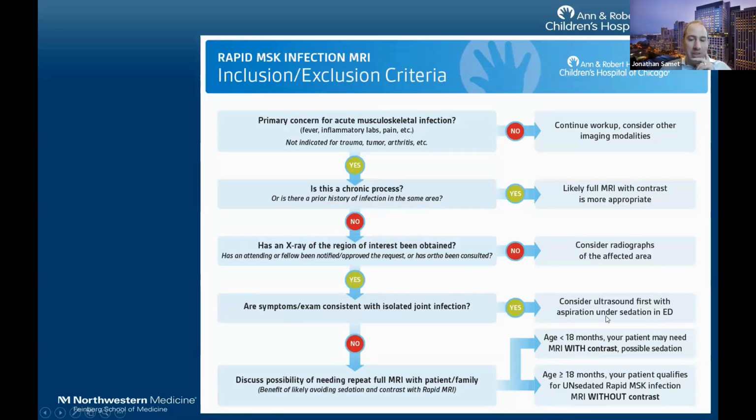We have typically done this only in patients older than 18 months, because with the unossified bone, people were worried about taking away contrast. So we'd only do it at 18 months and older. The more we've done this, the more I'm thinking you probably could actually just do it all non-con, but we have to prove that.